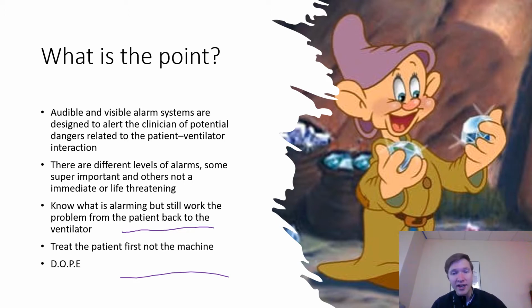And the final one on here, right, it's the last for a reason, is going to be E for equipment, right? Check your equipment. When in doubt, disconnect them from the ventilator and start manually bagging that patient, manually ventilating that patient. That's going to be your way to make sure it's not equipment. If it is an equipment issue, then you can see if someone can help you out there and rectify that and get them reconnected. So that's your basic assessment.